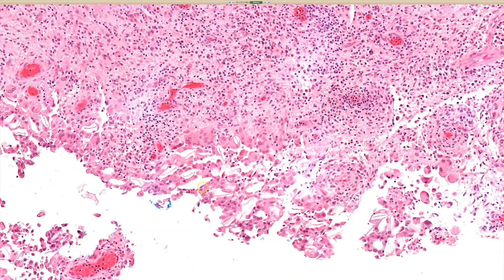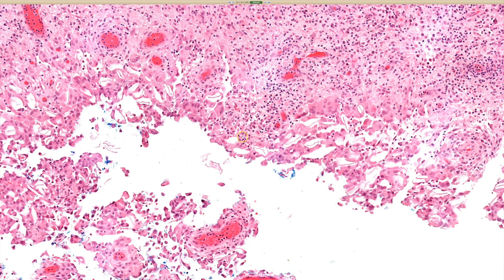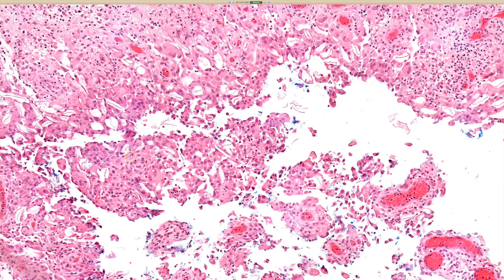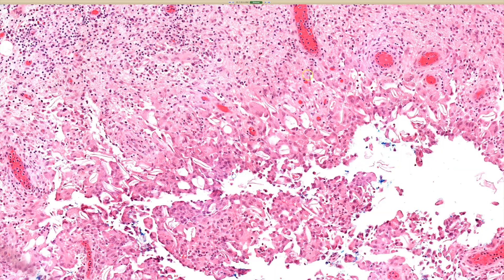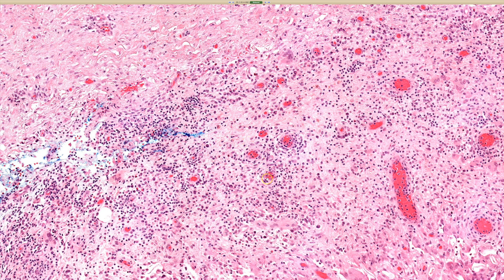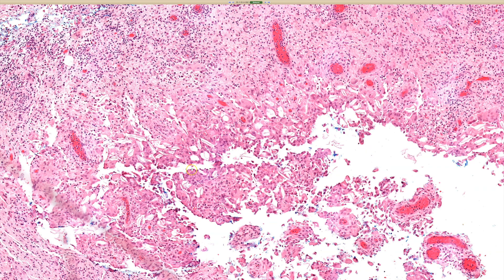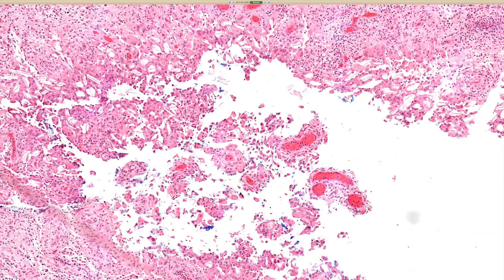Could there also be infection? Sure, always keep that in mind. You can have infection that produces cystic epidermal change and then rupture. But in this case, this looks great for a ruptured cyst. If I see granuloma and granulation tissue that looks like it could be a ruptured cyst, but I can't find any keratin or any cyst wall, then sometimes I'll say it's granulomatous and describe it as the sequela of a ruptured cyst — but note that I don't see keratin or a cyst wall. That way, for the treating physician, infection is possible, other things are possible. So if it doesn't get better after surgery, think about re-biopsying and culturing.